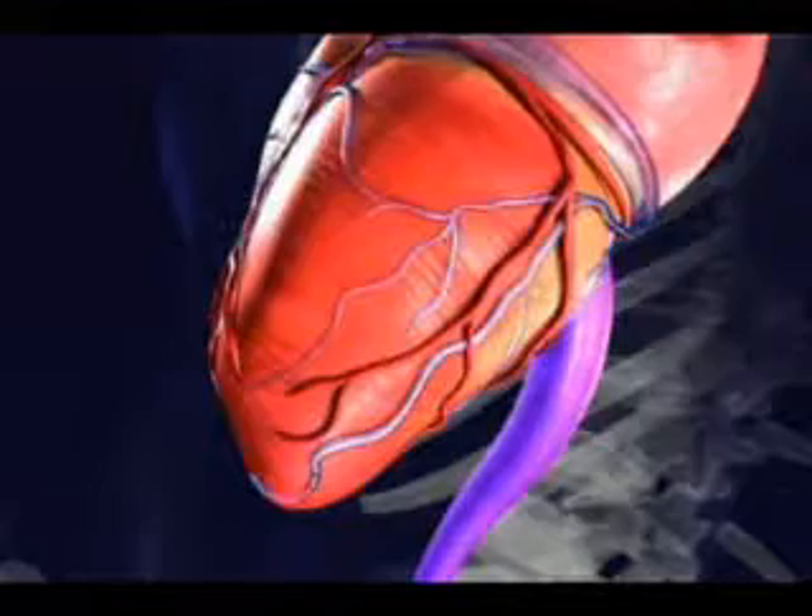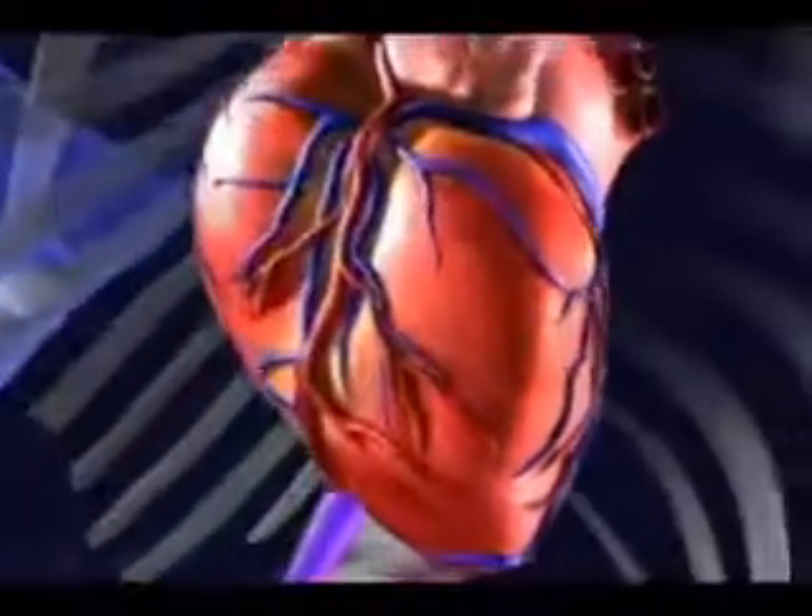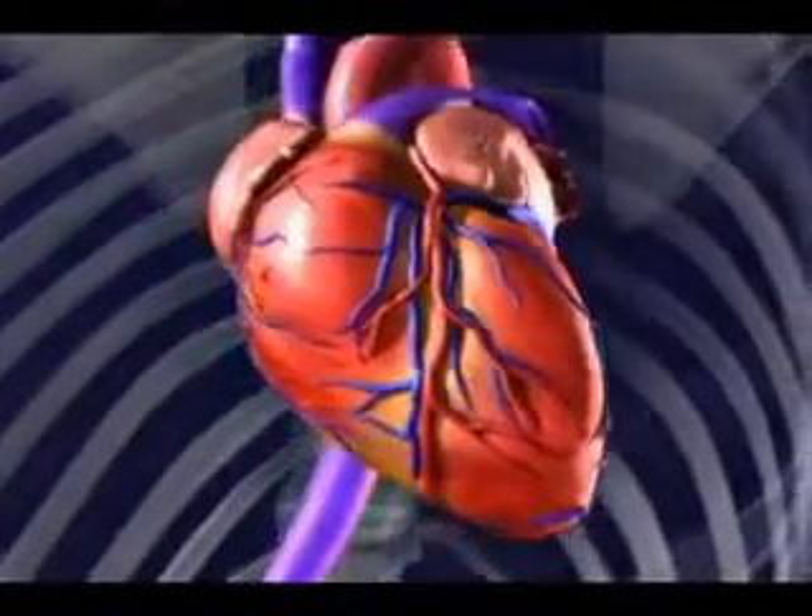After this lead is positioned and secured, all the wires are attached to the generator, which provides resynchronization and improvement in heart failure symptoms.